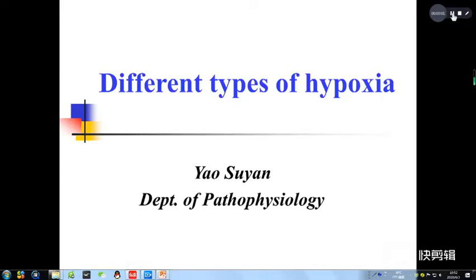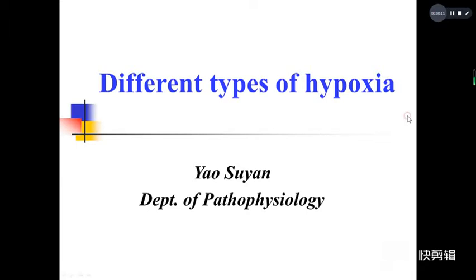Hello everyone. We have learned hypoxia. Today we will do an experiment on different types of hypoxia.